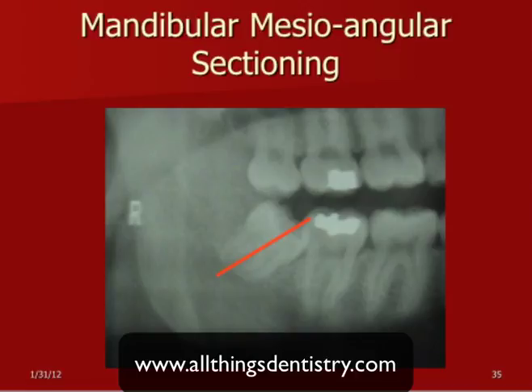Just for the answer, some of the things I've seen a few oral surgeons do. You do this after you would trough first, and then start the sectioning from the furcation. Usually, when you're doing the section, if I can find a furca, I'll start at the furca and come up. But a lot of times you can't see the furca. It's kind of a blind sectioning, and so that's why I like to uncover the crown.